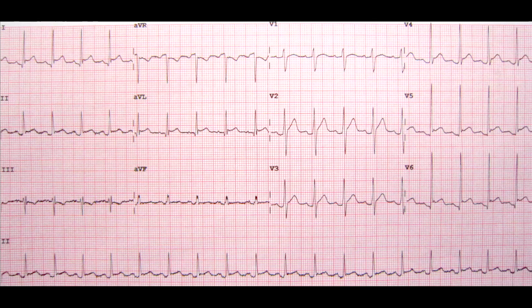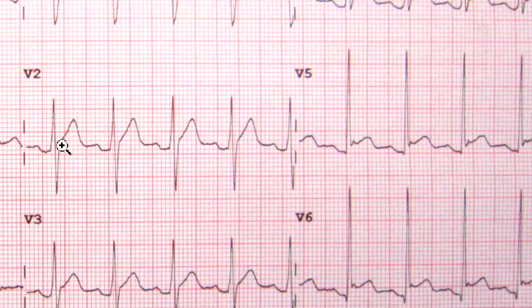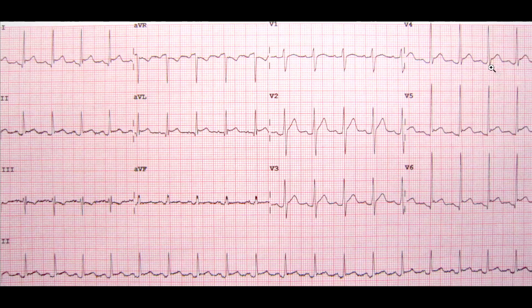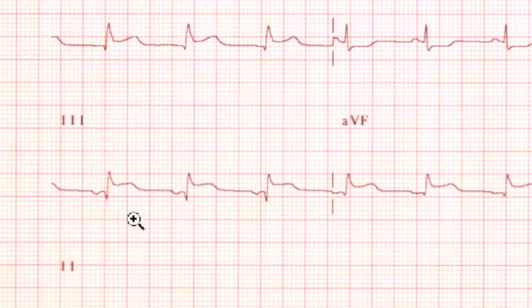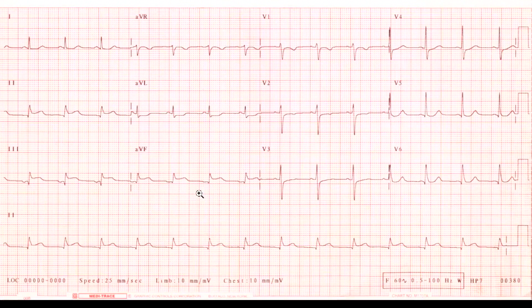The right patient needs to get the right medication. One hallmark of pericarditis is ST segment elevation in many different leads. Another sign is that this ST segment elevation is sometimes concave first, and then the T wave goes up. Notice all the T waves are pointing up — no T wave inversion — that's another sign of pericarditis. Also notice there's no first deflection down on the QRS complex, which we would call a Q wave. Going back to the myocardial infarction ECG, you can see those spiky little deflections coming down — those are Q waves, also suggestive of myocardial infarction.